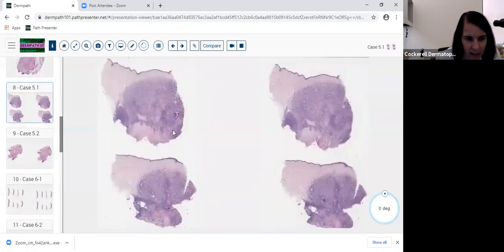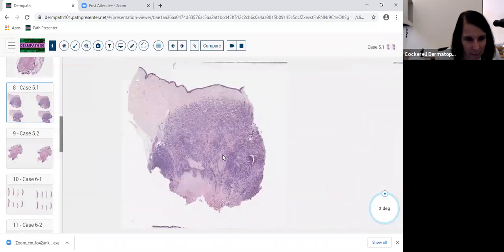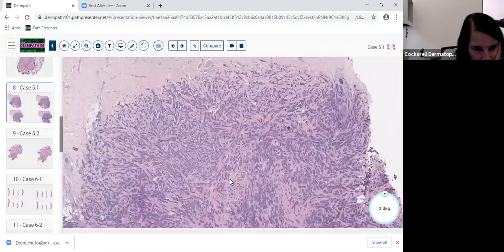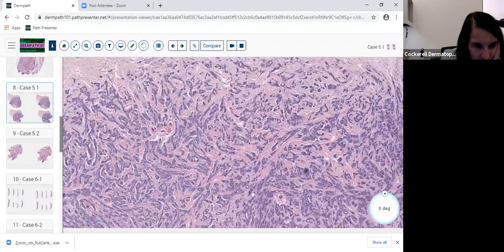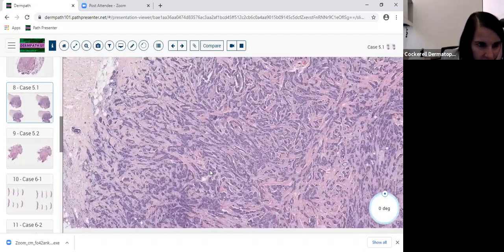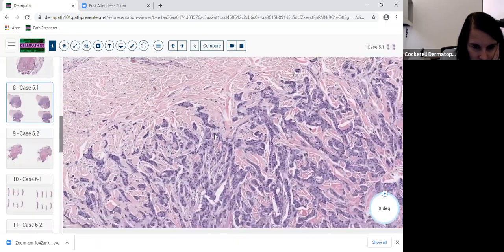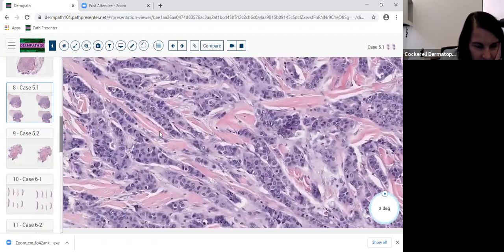All righty. We have another nodule in the dermis. You have a nice punch, sort of a punch excisional biopsy. This is a huge punch. And we have this process that looks like it's infiltrating. It is somewhat circumscribed, but if you look at the edges of this, it's infiltrating into the collagen. The stroma is very dense and sclerotic.